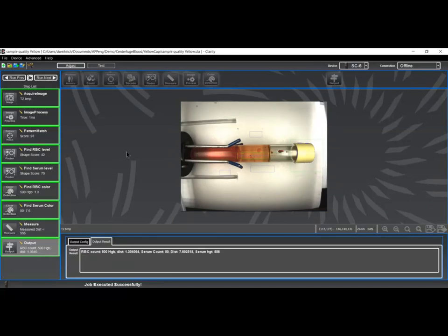Again, it's important to note that once this script is loaded into a machine vision platform, the only thing that is done by the host is to command the machine vision cycle, and the output here gives all the values that are part of the script. There's no other host part of the operation. The host is not required to do any processing itself. Machine vision scripts such as this can be retrieved from the machine vision platform and tweaked and then reloaded or re-uploaded into the machine vision platform.